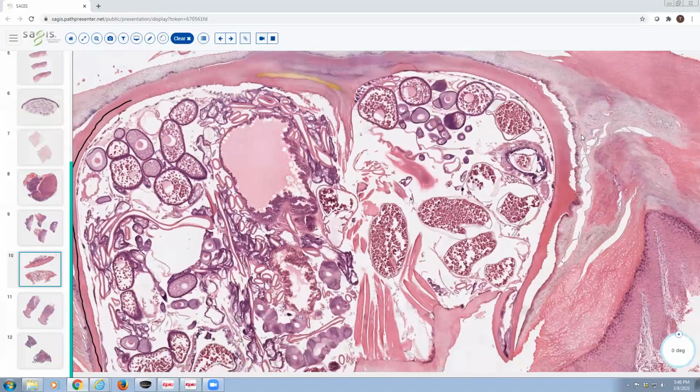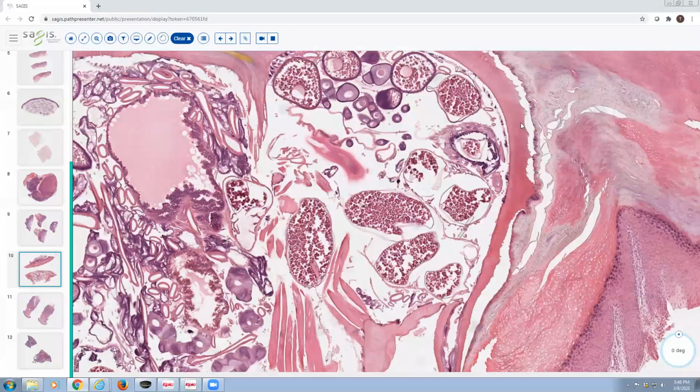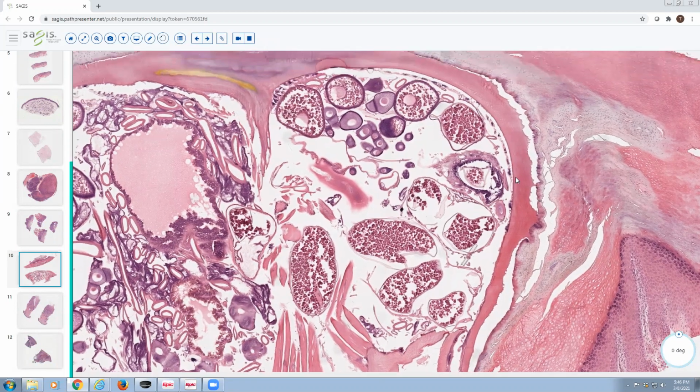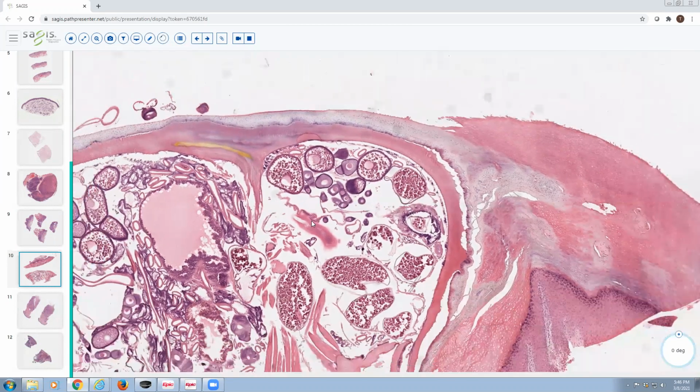And then also Tungiasis, while the outer exoskeleton can be kind of spiky, like a little bit spiny, it does not have the hooks or the pigmented spines that you see in myiasis. Those little orange spines or hooks that you see in myiasis, you will not find in Tungiasis. This is Tungiasis. Okay.